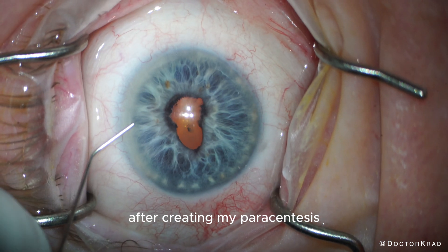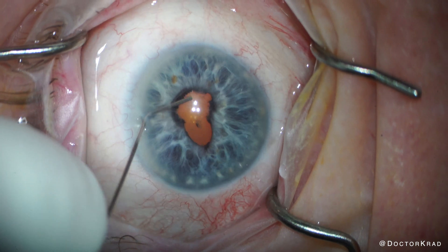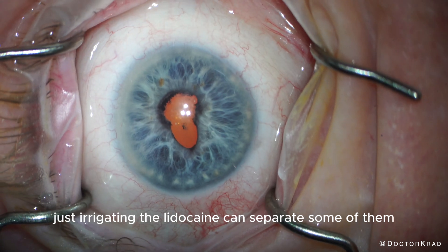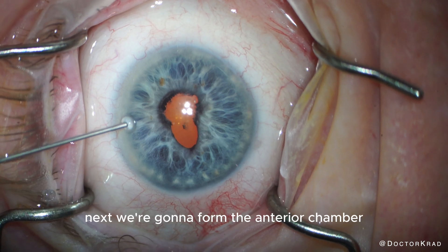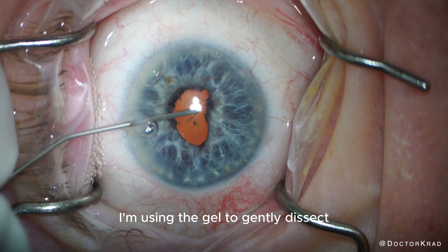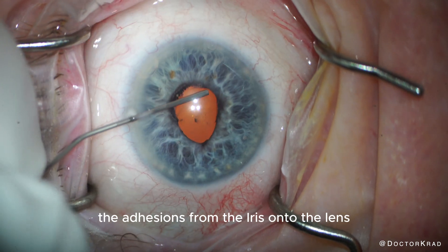After creating my paracentesis, I'm going to irrigate the anterior chamber with preservative-free lidocaine and epinephrine. Sometimes, if the synechiae are mild, just irrigating the lidocaine can separate some of them, but in this case it looked really dense. Next, we're going to form the anterior chamber with dispersive viscoelastic. I'm using the gel to gently dissect the adhesions from the iris onto the lens.